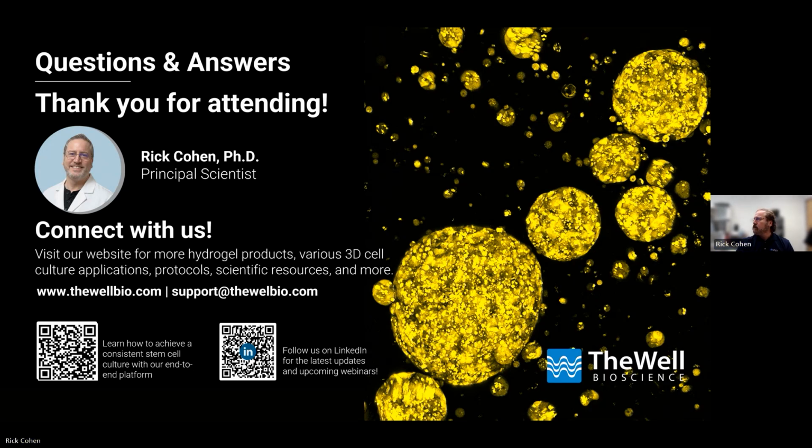Thank you. We do have a few more questions. Compared to a traditional method of thawing into 2D first, what are the expected recovery rates and day 0 attachment efficiencies for this direct-to-3D approach? So the short-winded answer is, I don't know. The reason is, I don't know how well you've prepared your frozen cells, but we recommend, if you have the ability, to thaw Accutase or TrypLE dissociated cells. So if your input is single cells, the recovery is best.